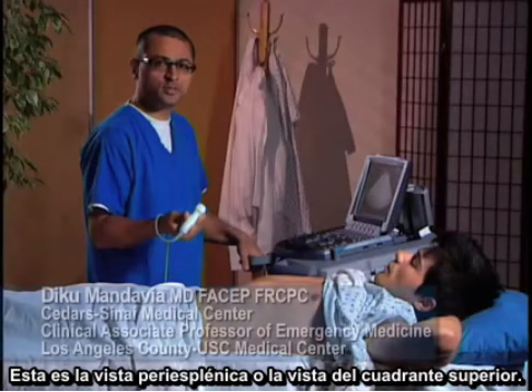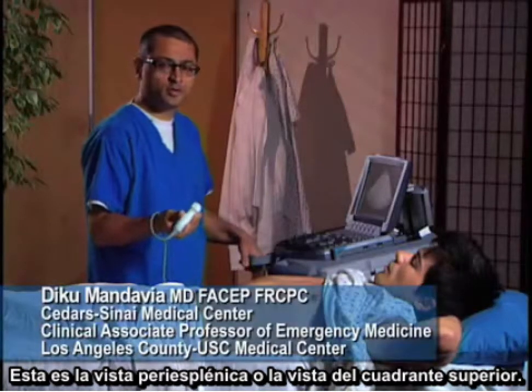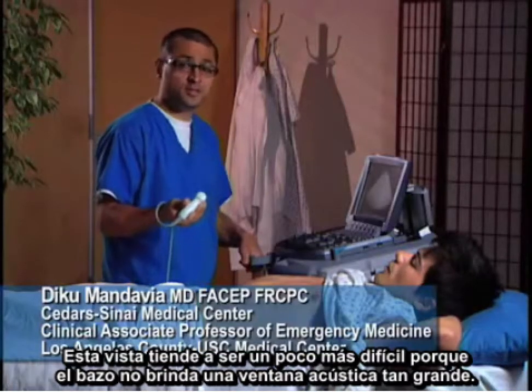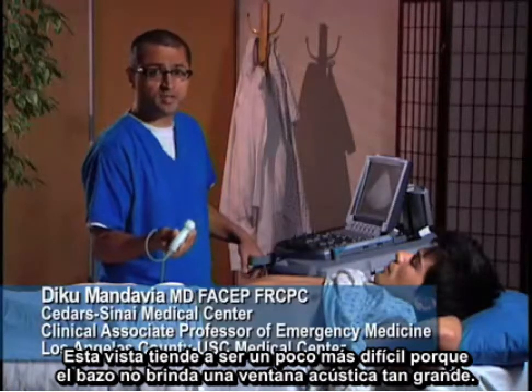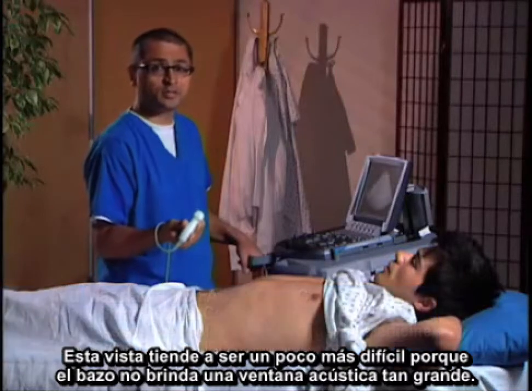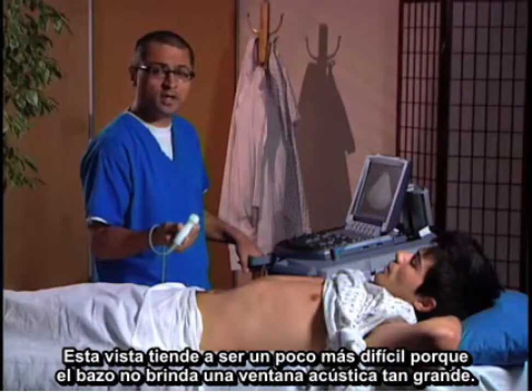The next view I'm going to take you through is a perisplenic or left upper quadrant view. This view tends to be a little bit more difficult because the spleen is smaller and doesn't provide as large an acoustic window.